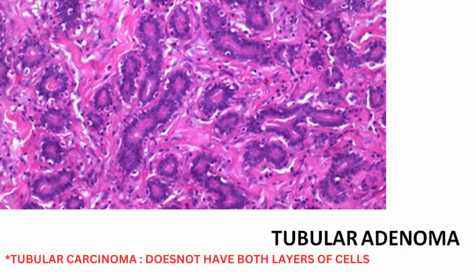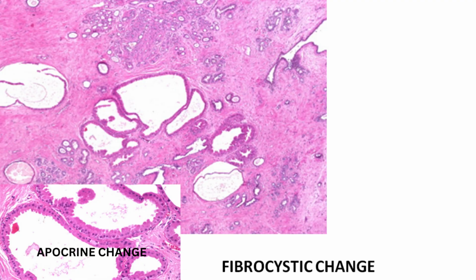The stroma is very minimal here, okay? That's why it's tubular adenoma. So now there's something called fibrocystic change. This might be seen grossly as sometimes cysts scattered in your fibrotic breast tissue. Of course, it occurs from 25 to 40 years of age, and in this image you can see variable size of these cystic structures. These empty looking things are your cystic structures, and they're of various sizes and shapes, right?